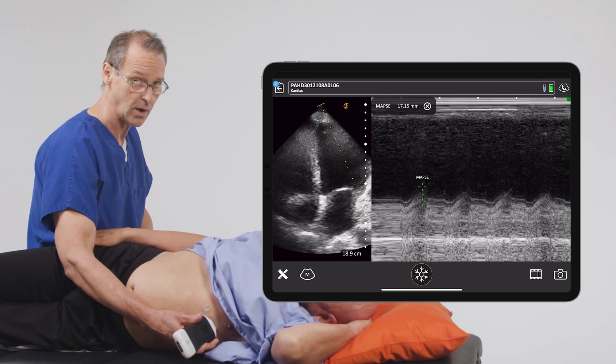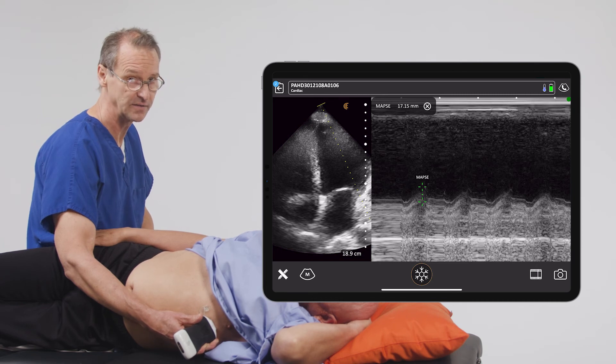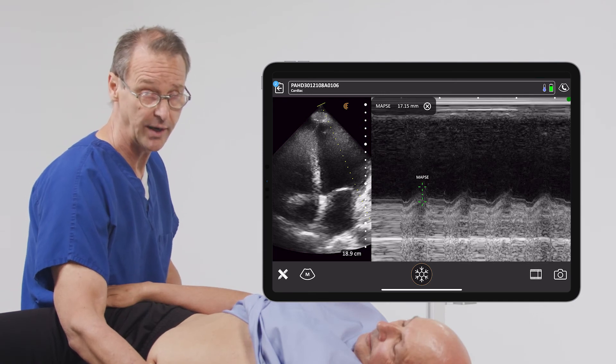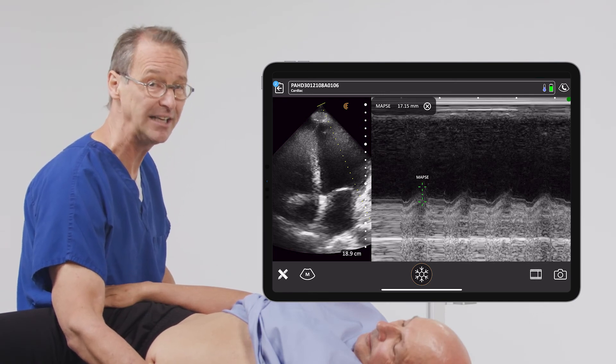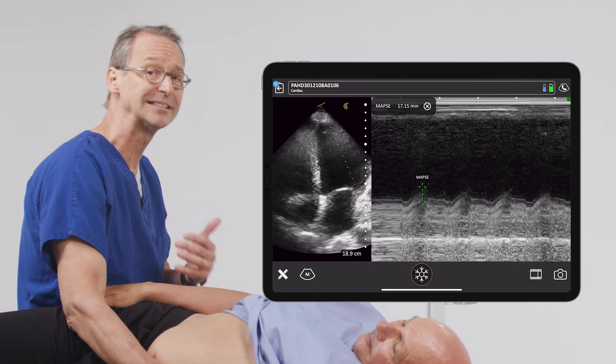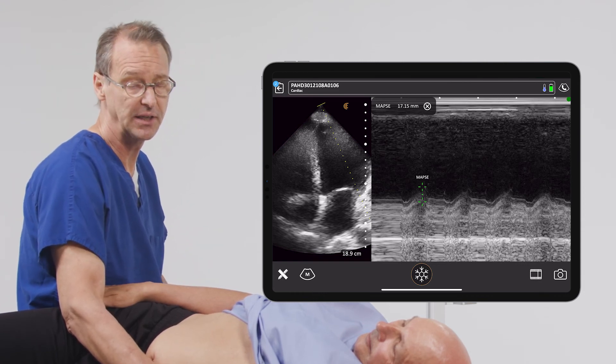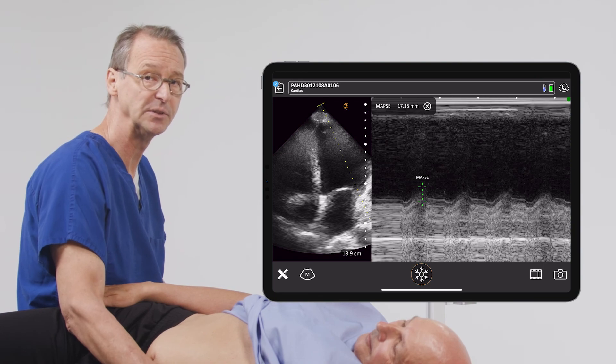Normal for an adult male is 13 or greater, and normal for an adult female is 11 or greater. We can see that this patient has a very normal MAPSI value. In summary, MAPSI is a great way to very quickly and quantitatively estimate your patient's left ventricular function, and it gives you a lot of information for taking care of a variety of conditions that we see in the emergency department.